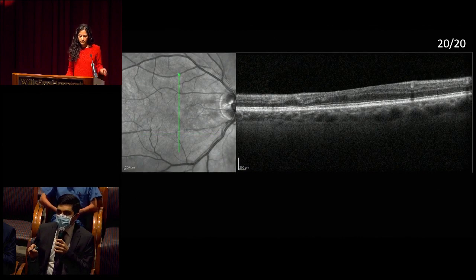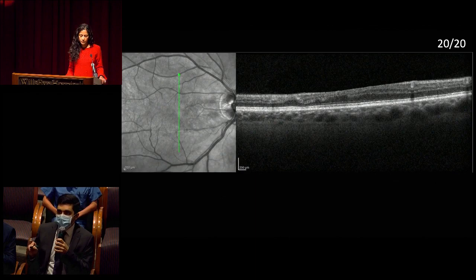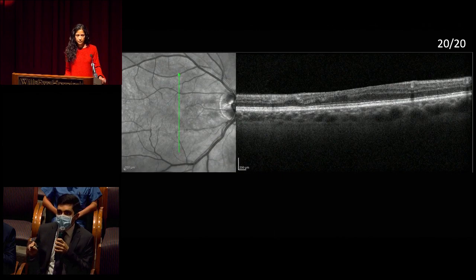This is a vertical cut through the macula, which nicely shows the differential asymmetric involvement — inferior versus superior macula. The superior macula is much better preserved in terms of retinal laminations, while the inferior retina shows those inner retinal changes corresponding to the area of arterial involvement.